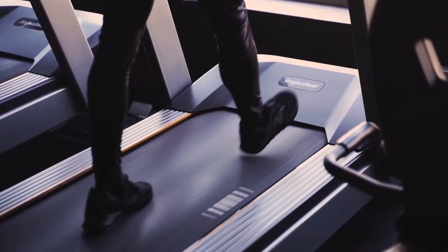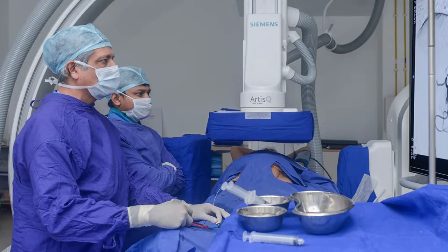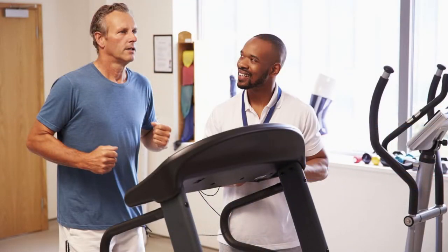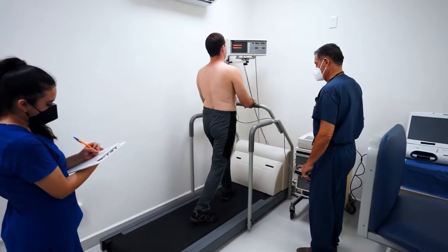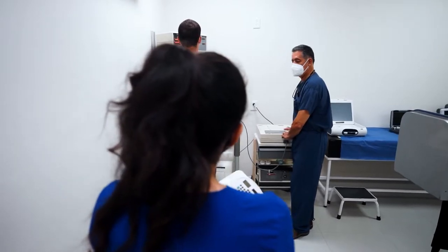An inconclusive treadmill means there are some changes but there are some baseline ECG changes, the patient has not walked for a long period, or the target heart rate has not been achieved. If changes are present but not conclusive, the report is considered doubtful or inconclusive. A strongly positive treadmill with gross changes and significant risk factors warrants angiography. If the treadmill has mild changes or is negative, the patient can be kept under follow-up. If changes increase or the patient's condition deteriorates, then angiography is done. Even without achieving target heart rate, a positive report can be given if ECG changes are present, but a negative report cannot be given without adequate exercise.